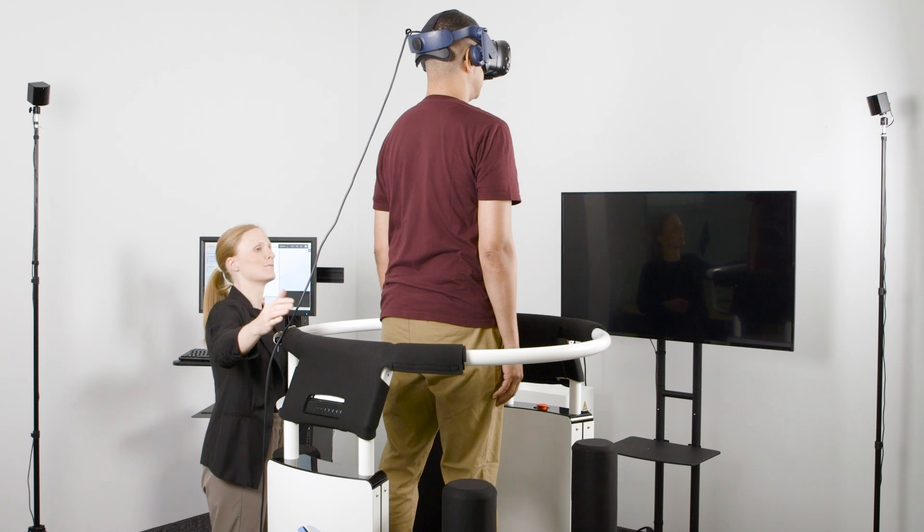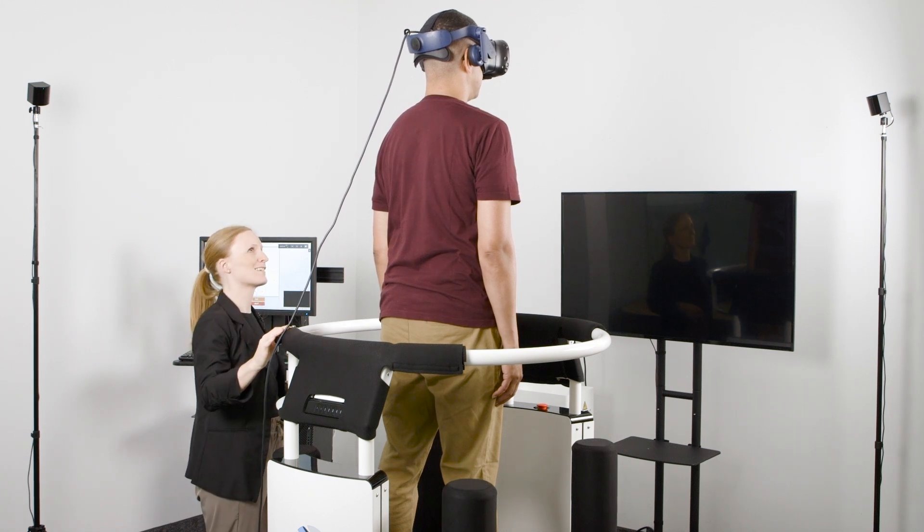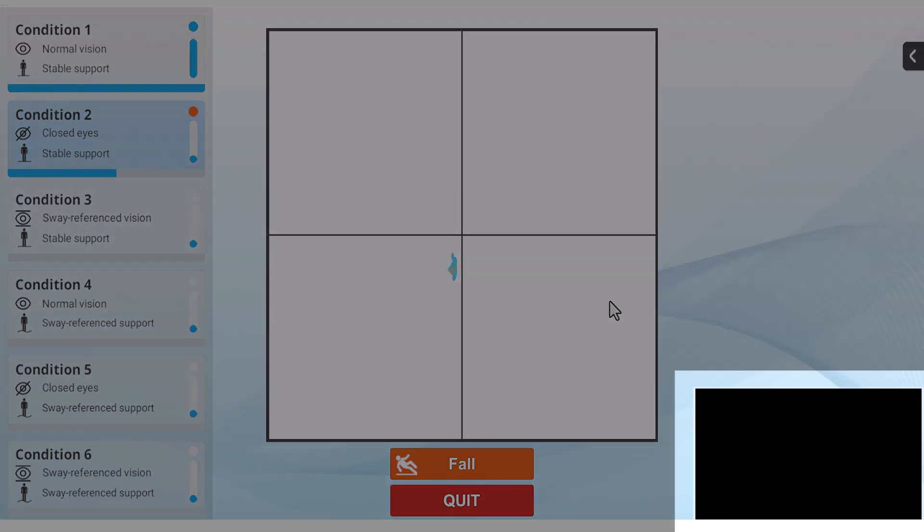After completing condition one, the patient will be instructed through the headset to close their eyes before beginning condition two. The image in the headset will turn black to simulate eyes closed.